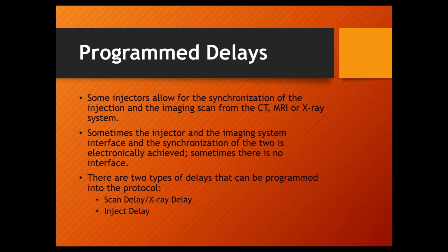It's very common among CT and angio injectors. MRI injectors, and I assume it's just due to the nature of an MRI system, MRI injectors don't electronically interface with imaging. It's not an option for them, but CT and angio do.